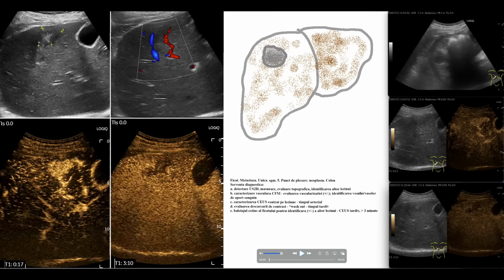It is a classic metastatic appearance with a somewhat more echogenic center and a more hypoechoic periphery, the peritumoral halo. The tumor formation is clearly solid tissue, parenchymal and measurable. It is oval in shape with an anteroposterior craniocaudal axis of about 2 and a lateral axis of about 3 centimeters. So it is a clear tumor formation.